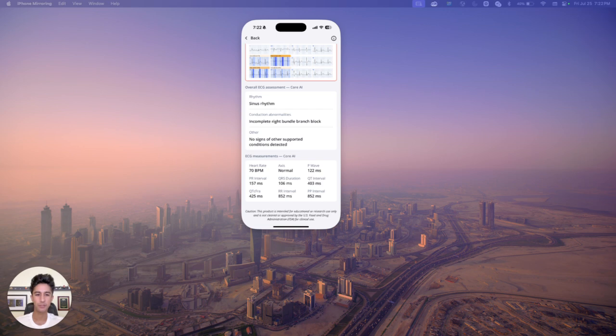There are 36 core diagnoses that it can predict, things like AV blocks, atrial fibrillation, atrial flutter. It can take a picture of any 12-lead EKG, including ones on computer screens, which is helpful because a lot of times an EMS unit may send an EKG, and you may want to see what this says about it.